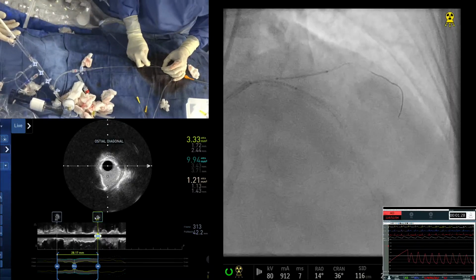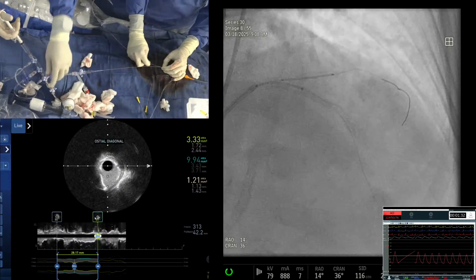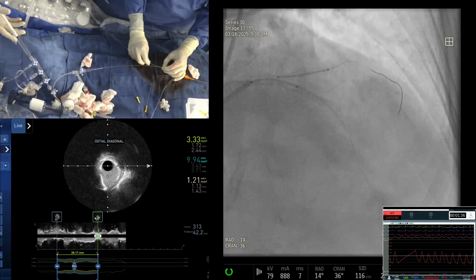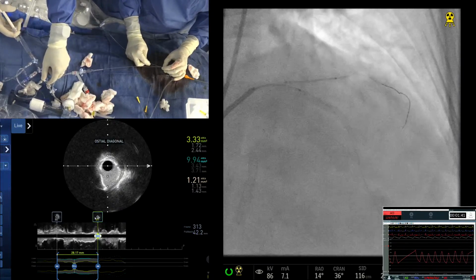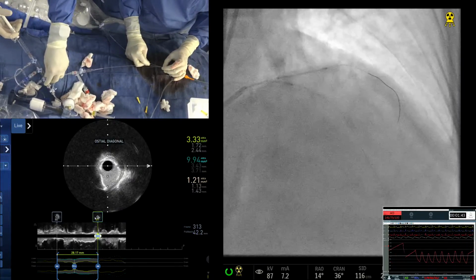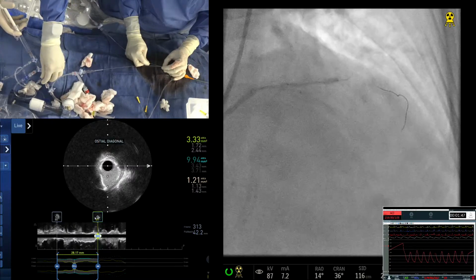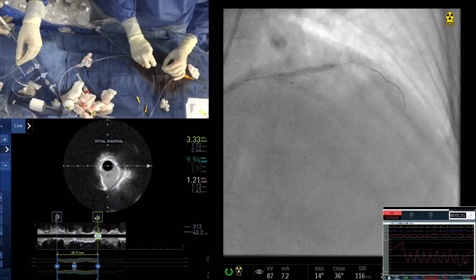We are going up now. In the right, inject. Inject, okay. Little angulated, but that's okay. Wait, I'm going to go in a little bit more. Yeah, you can push a little bit in. Okay, good. Now you go up. I'm going up in the diagonal. Yeah, I think this will also address the left main.